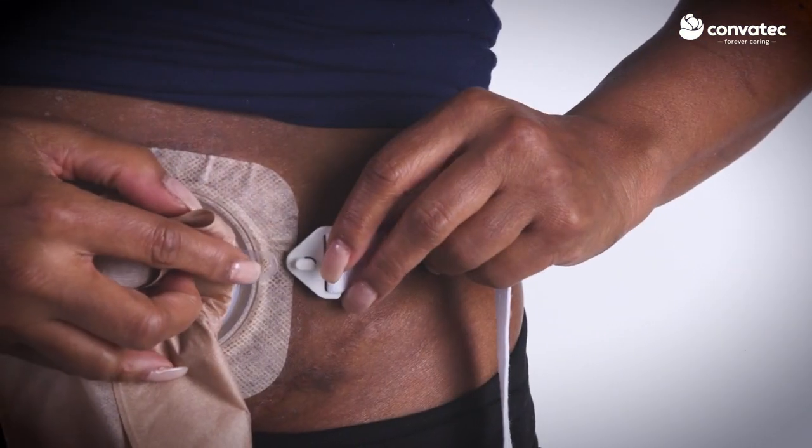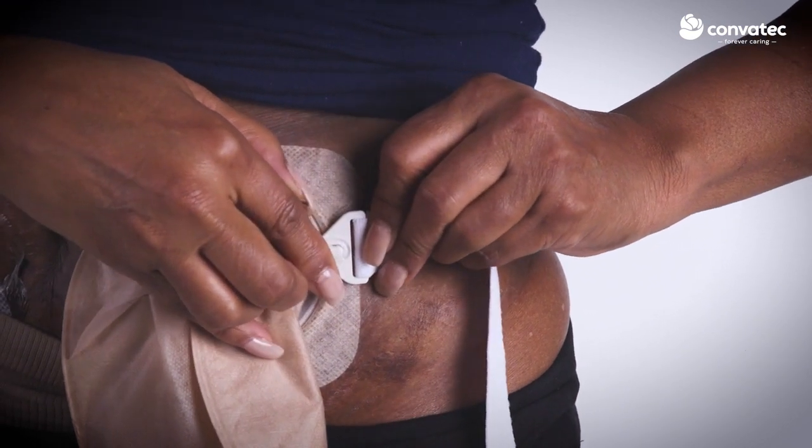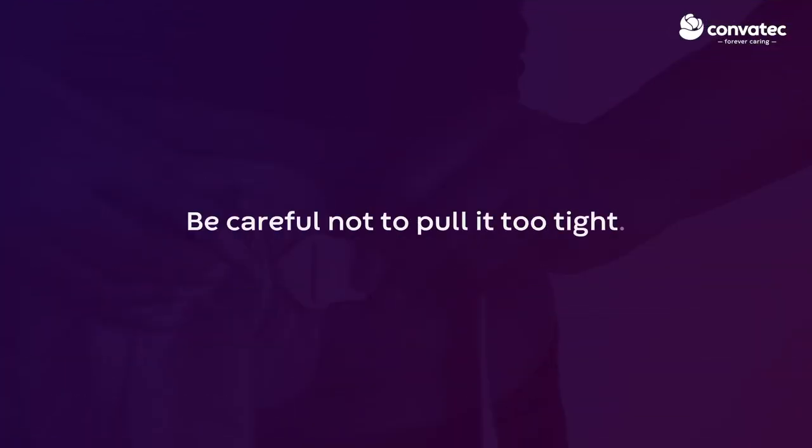Attach the belt to the tab on one side of the pouch, with the belt tab facing away from your skin. Then pull the belt to ensure it is secure. However, be careful not to pull it too tight.